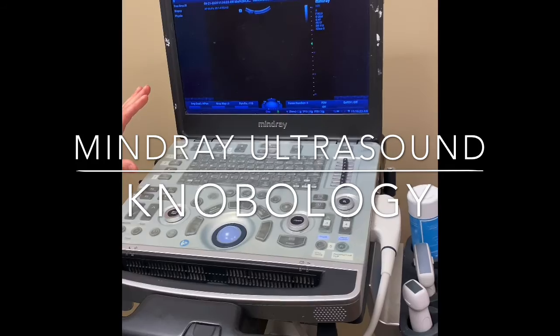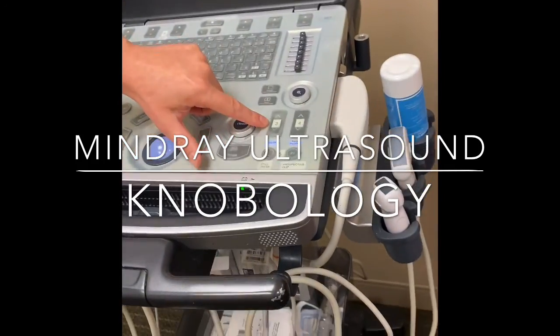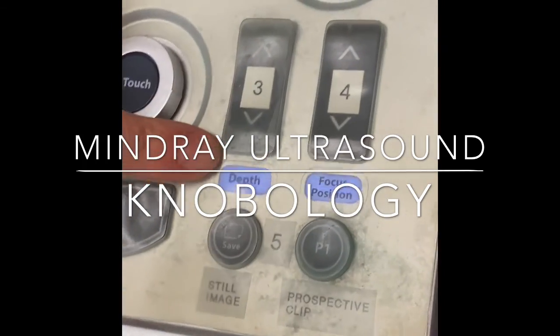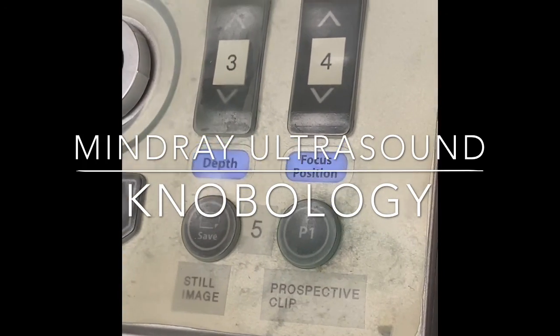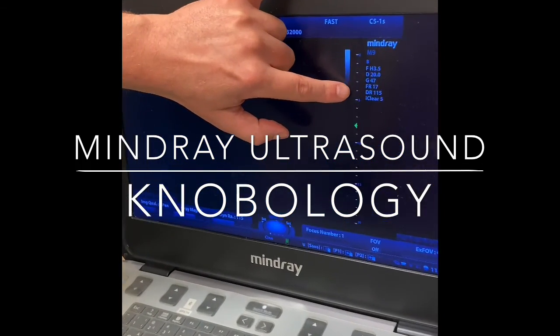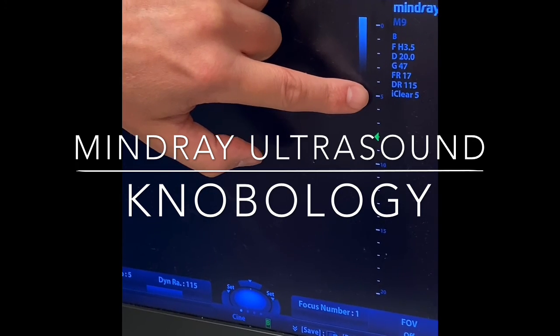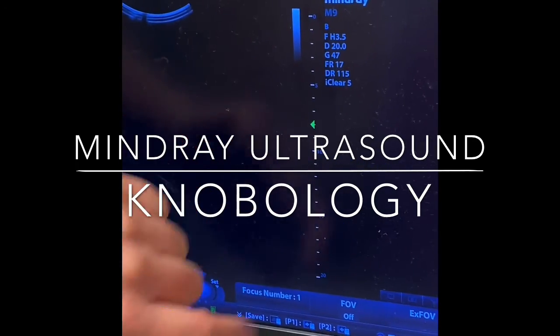Once you're set up by the patient, the next step is to make sure that you have the appropriate depth. That is step 3 labeled here. You'll notice that on the machine, there are depth markers. Each of these hash marks is 1 centimeter. You will also see every 5 centimeters is labeled 5, 10, 15, 20.